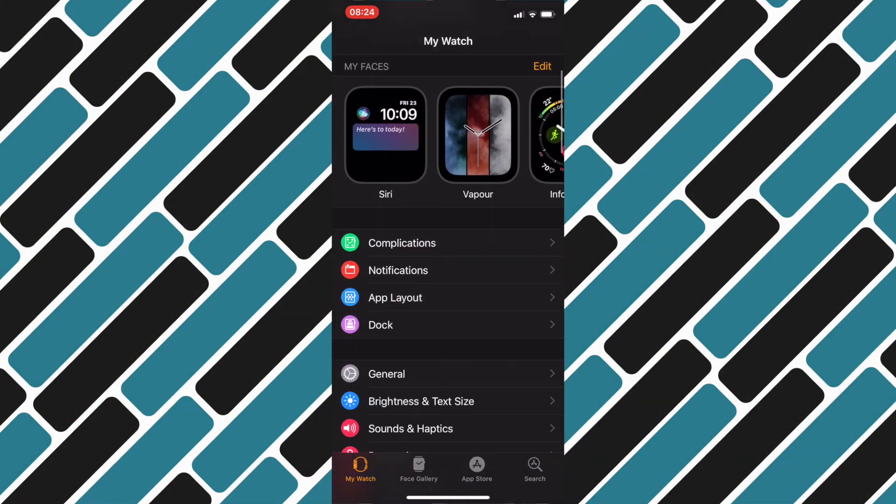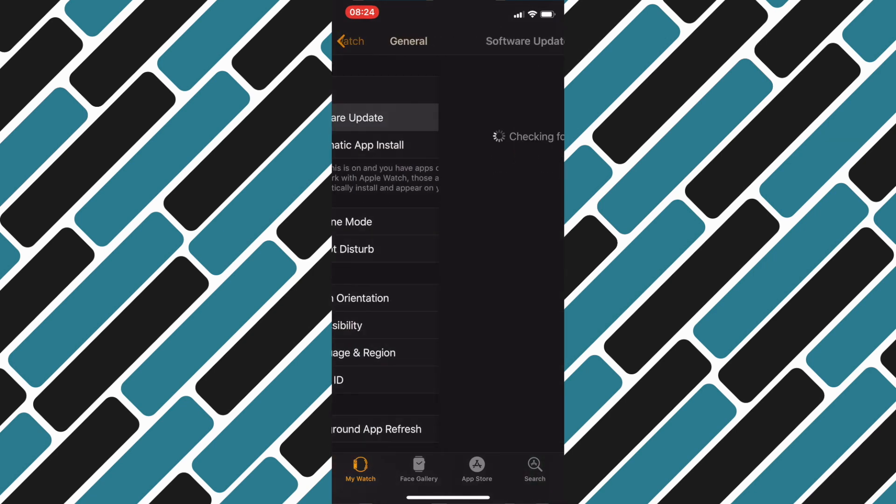The first step is to go and check that you've got the right version of WatchOS running — this will be 5.2 or above. Go into the Watch app on your phone, then go into Software Update and just check that there are no updates available and that the version is 5.2 or above. You'll only need to do this once.